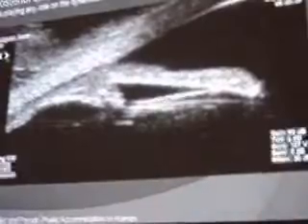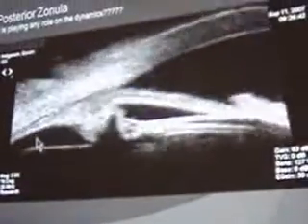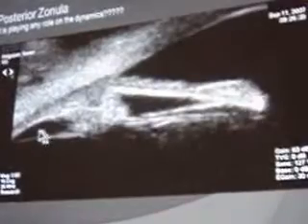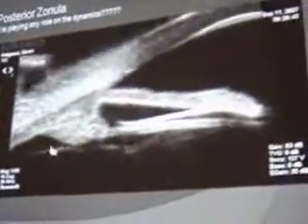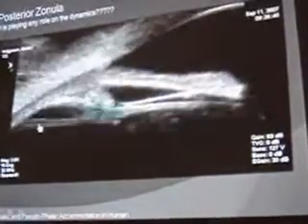Okay, here is one fact that has been discovered recently. Look at the video clip, which is going to be running on a loop, and look at this area. The thicker line at the end is the vitreous base. That's clear, it's known, it's present in all patients. Well, what happened here? But there are some. Okay, just one second.